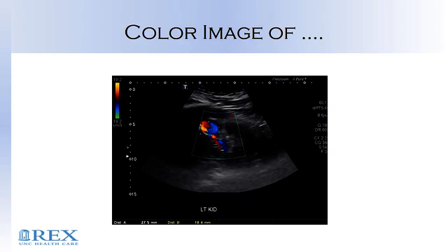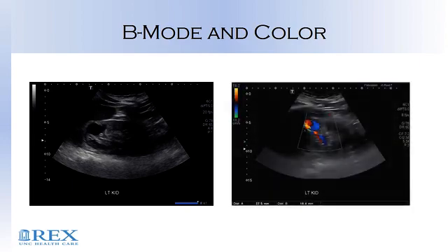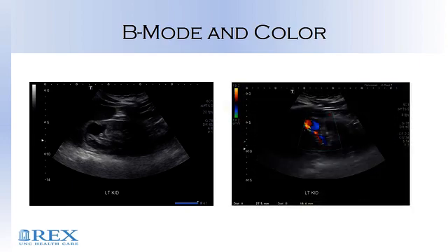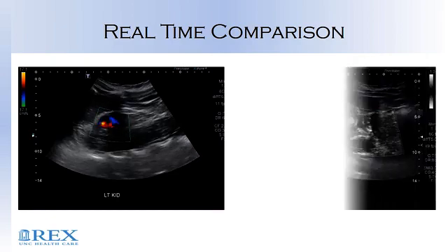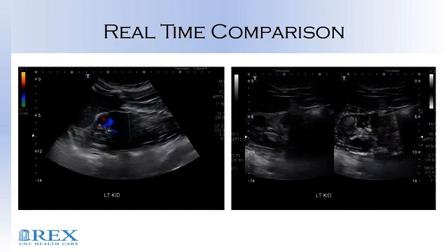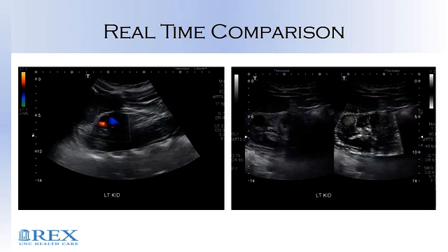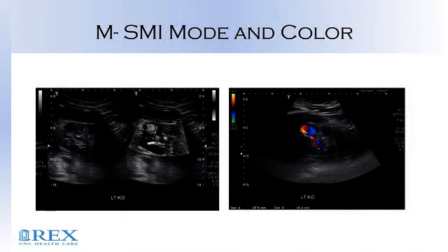I asked the patient — they didn't have any procedures done, no secondary trauma or anything. So things weren't adding up. Looking at this beautiful color image, just by hitting a button in real time, you can see the color flow within what we're thinking is a pseudoaneurysm. I don't have time to show the Doppler interrogation, but this is the difference of SMI. You can see the fine delineation of the vessels, and this turned out to be a mycotic renal artery aneurysm — very rare.